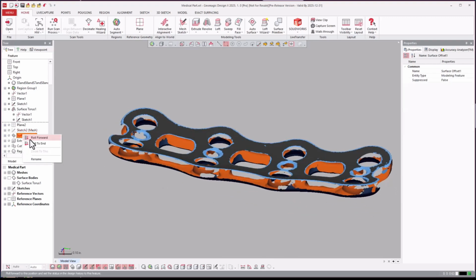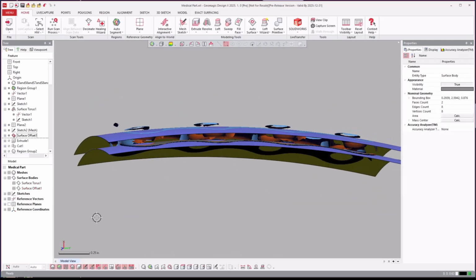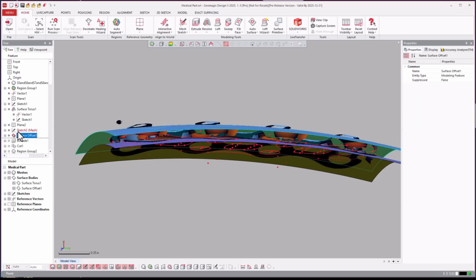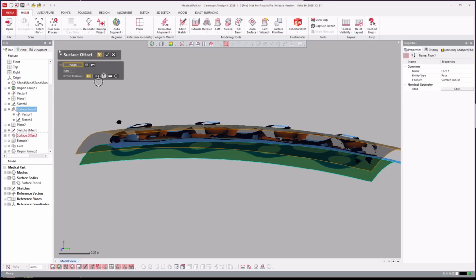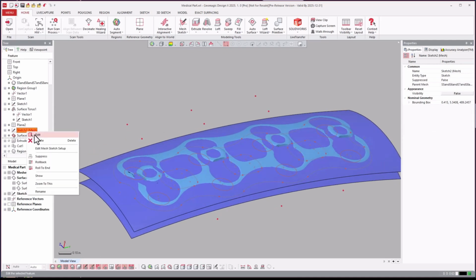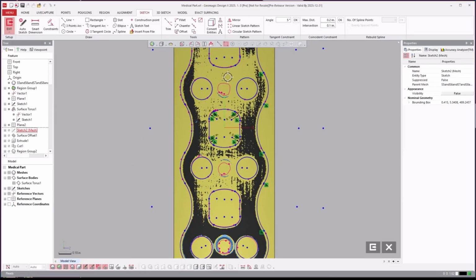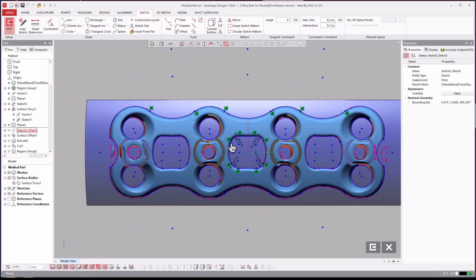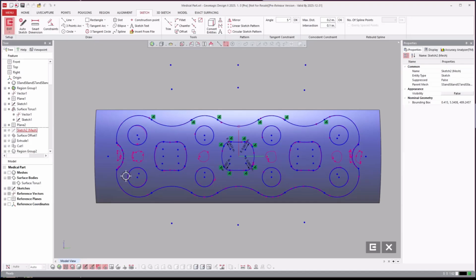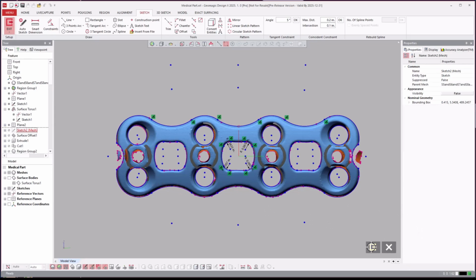And then we go into an offset surface. We'll turn our surfaces back on and toggle that other surface. We went ahead, it's a constant thickness, and it validated that it is by offsetting it. And you see here that you can double click on it and see a 0.1 offset value there. And you see they also went ahead and did a silhouetted mesh sketch as well. So if we come over here and let's just flip around there, turn this off, turn that off, and you see they went ahead, here's the mesh, they went ahead and drew it all out and created the geometry that we're going to use to create a solid from it.